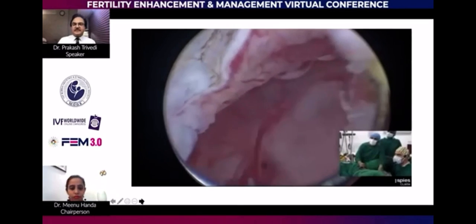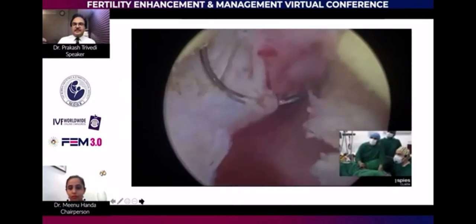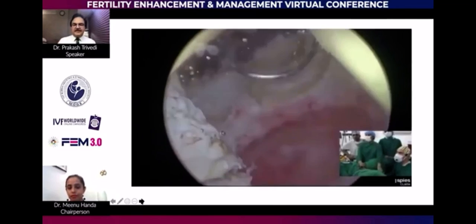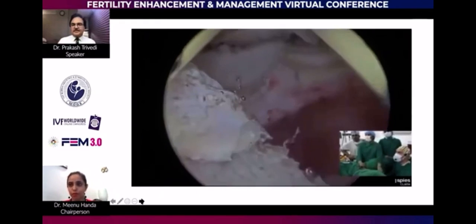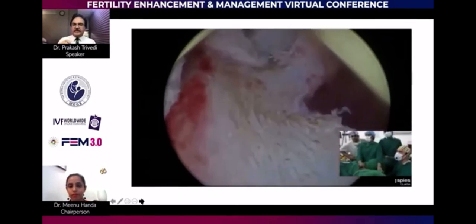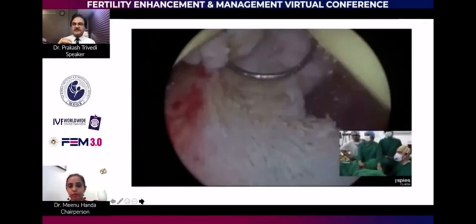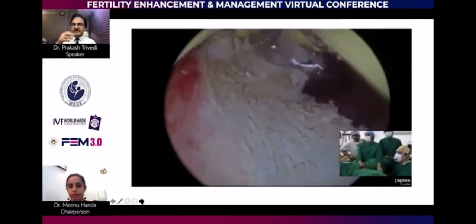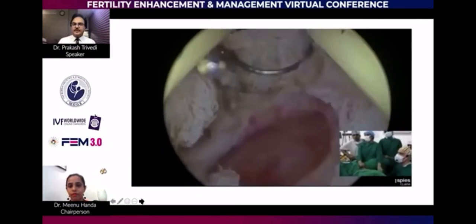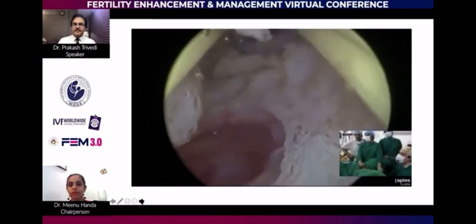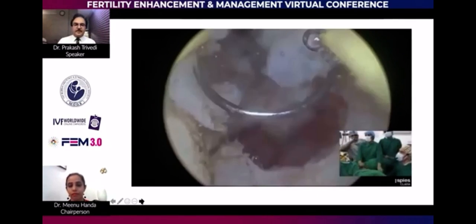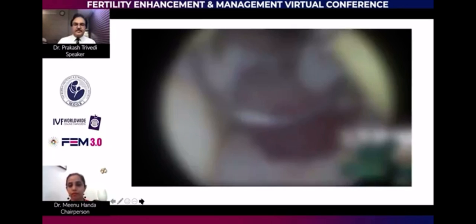You have to be careful — if this adenomyoma is present and you transfer an embryo that lands there, you won't necessarily achieve implantation. Don't be over-enthusiastic; while trying to remove the entire adenomyoma, you may remove too much endometrium. That is not the right approach — at some point, coagulate the base.